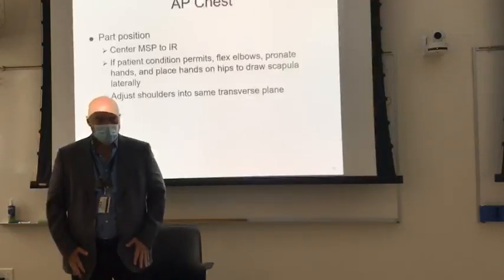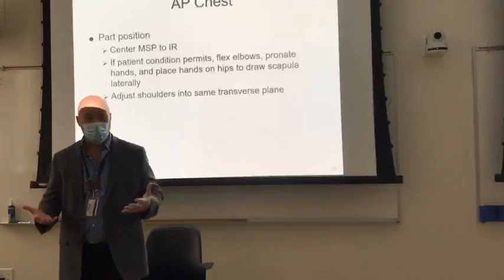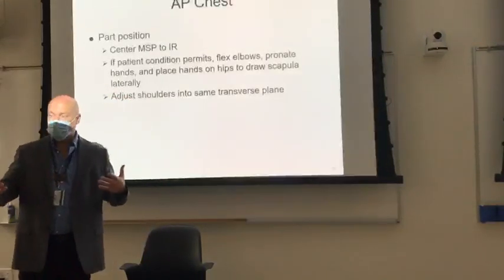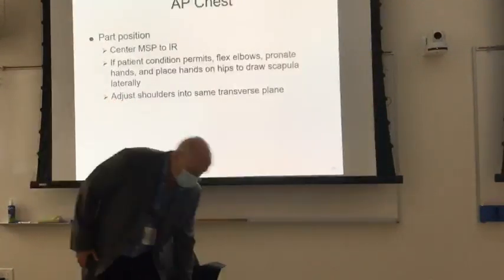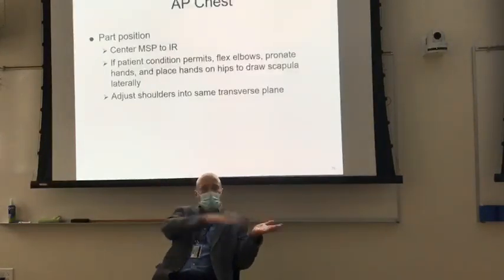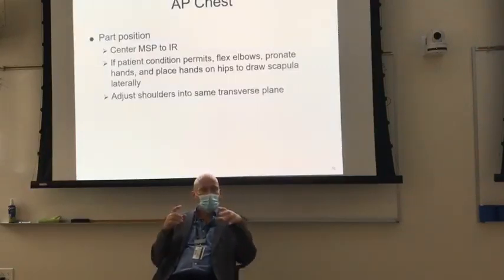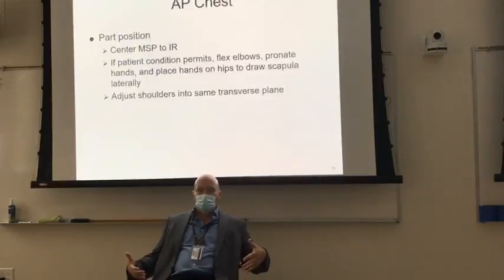So what we're going to do is sit the patient up as much as you can, but there's a process, okay? So you walk into the patient's room, patient is kind of slouching on the bed because, you know, they're sick and they can't stand up. So what you're going to do is lay the bed down first, and then you should have a draw sheet, and a draw sheet is just like a regular sheet, but it's folded over and over and over. So it just goes under their hips, okay?